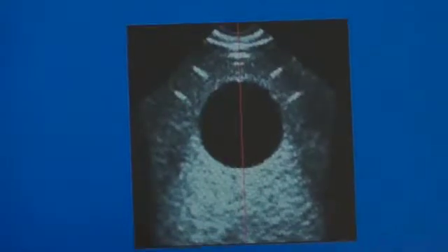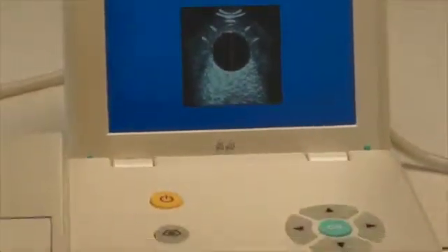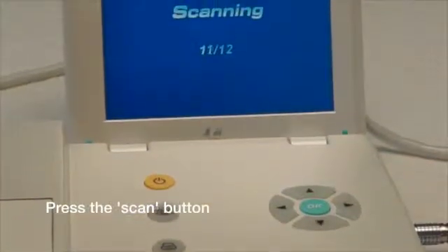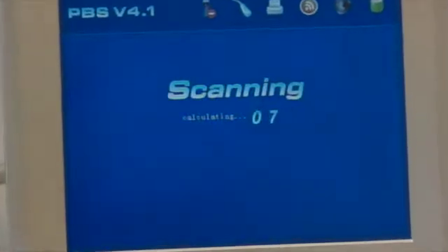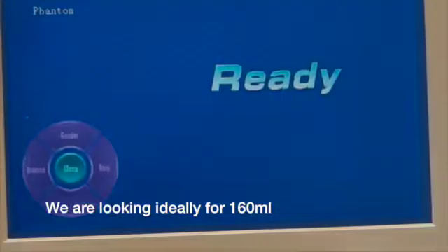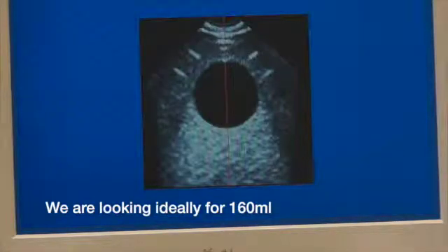Here you can see the image showing the red line passing through the center of the black sphere, and we're now ready to press the Scan button. Here you can see the results showing up as 158 mils, which is really, really close to the 160 which we're looking for.